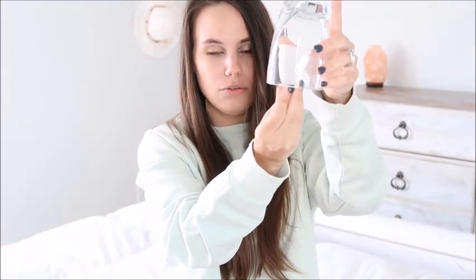After it pops open, you want to slowly turn the cup. If this is your first time doing it, you want to twist it while it's still out a little bit. So just twist it in a circle, because when you twist it, that's gonna let the cup open up completely and it's gonna help it to suction. And then after you've twisted it, you slowly push it in a little bit.